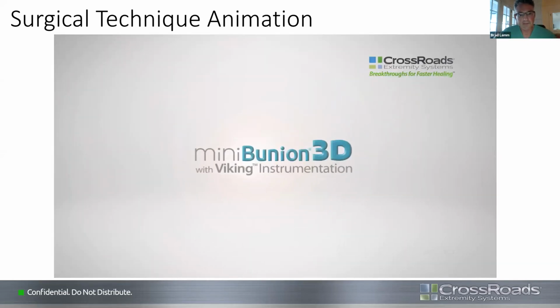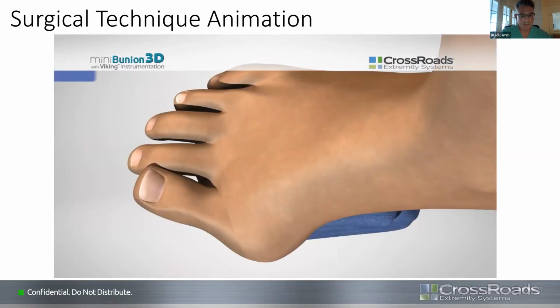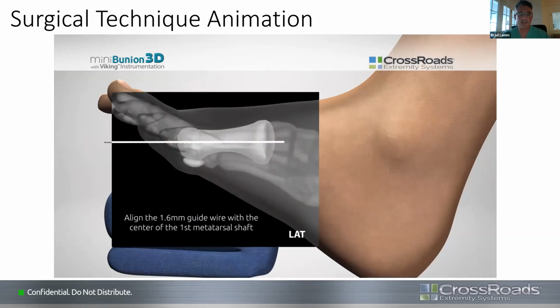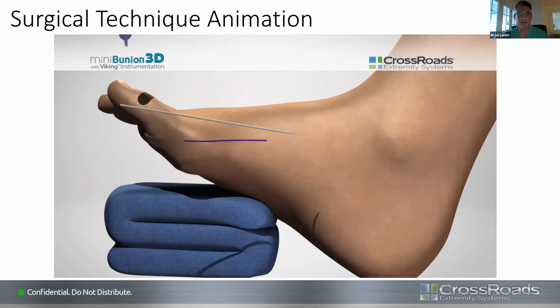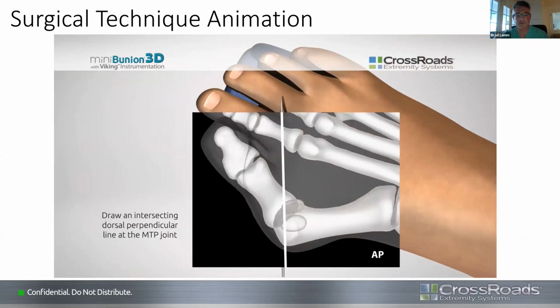You know, the big thing is you have to use fluoroscopy a lot more with these minimally invasive surgeries, so you can make sure you're in the right position, because you can't see everything. So you want to use a bump. You basically use the bump so you can get 90-degree imaging. You use a wire along the first metatarsal laterally there, and you draw your central axis line on your first metatarsal.